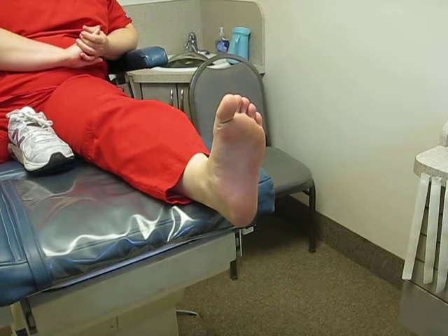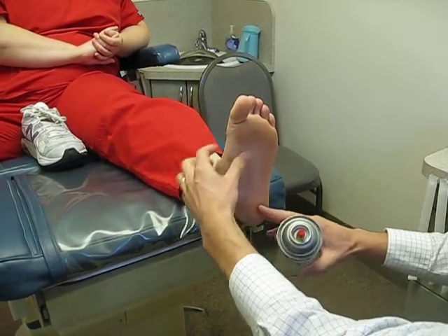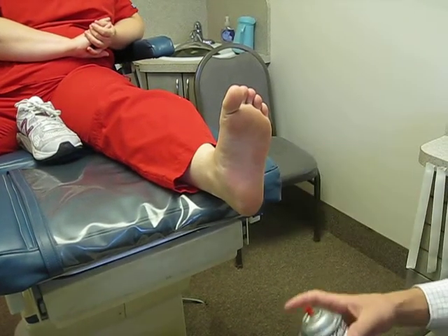This is a demonstration for low dye taping. It can be used for plantar fasciitis, chronic heel pain, as well as any mid-arch fatigue. It can also be used for athletes prior to an event or for someone in dire need.